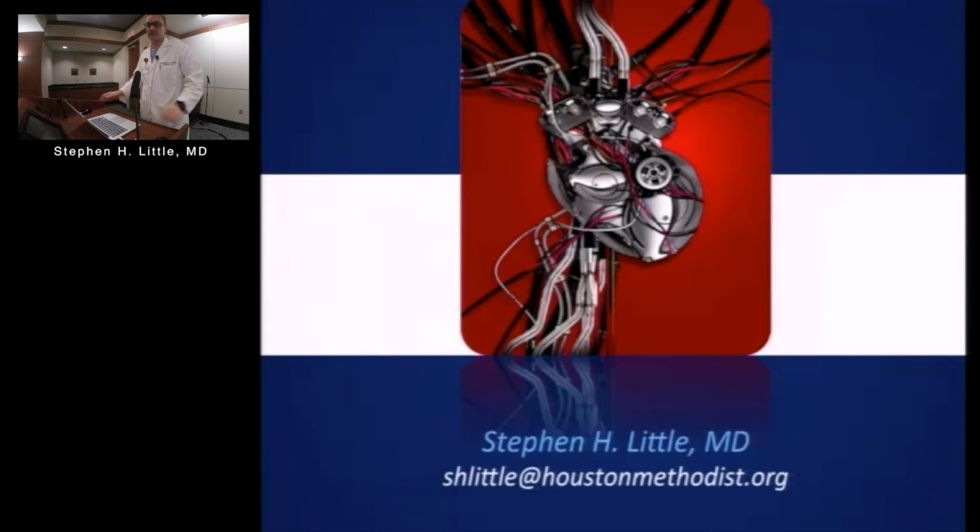One of the real problems, and we'll talk about it in the review paper or in the guideline we're writing, is it does a very tricky thing sometimes. You put one clip on, and if you look from above, you see the residual regurgitation comes lateral. So you're looking down from the top, there's a clip here, and a clear lateral jet. But when you flip it up or you look from the ventricle, the jet actually starts on the medial side and crosses over under the clip and appears on the atrial side to be lateral. Now what do you do? Do you clip it where you see it in the atria, or do you clip it where it originates in the ventricle? We've got a bunch of cases where it actually crosses like this. And you're like, I don't know what to do.